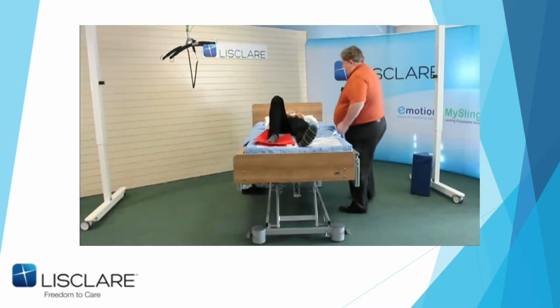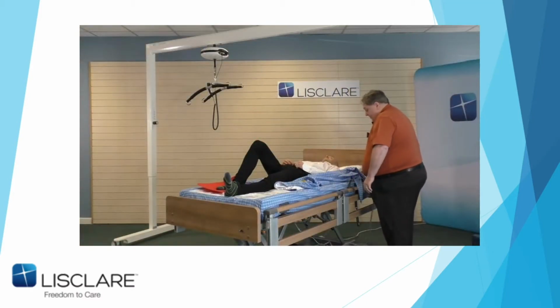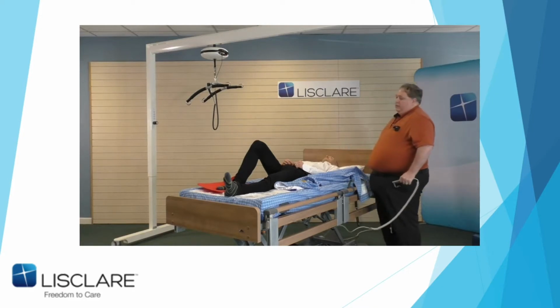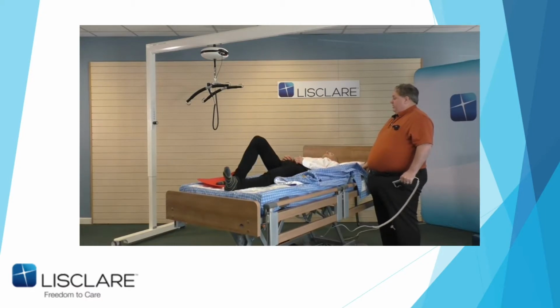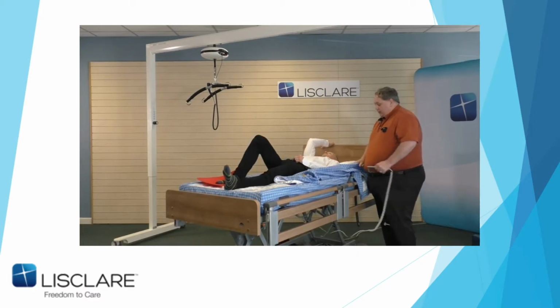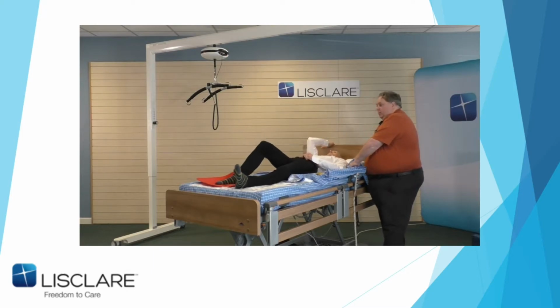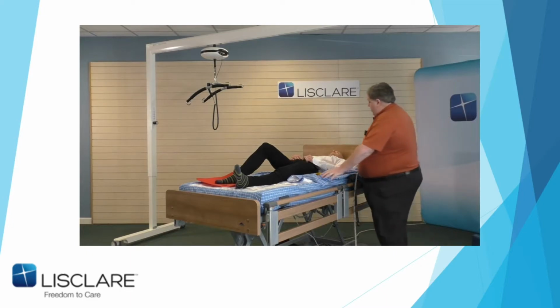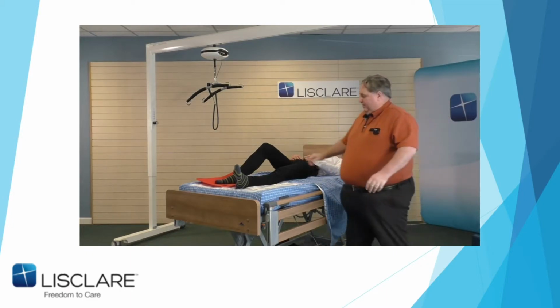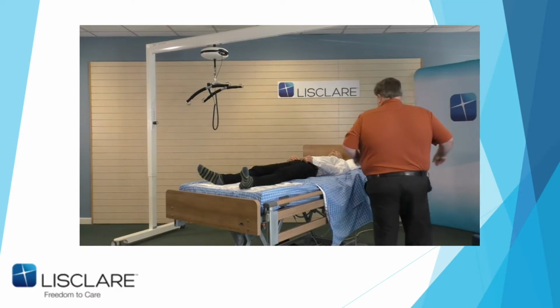Again, because I'm 6'2", this is where John and I work together. Okay. Now, I have even seen in the case of one client, in Mayo in Ireland, that the person reached behind them with their good hand. John, if you reach and just hold the headboard. And at this point, I will stand here and we'll go on ready, steady, slide. And John pushed his right hand side up and I just did the left, okay? So now he's in a nice position so I can profile the bed. So John, this is his feet up, please, and thank you. Thank you, John. Made for that.